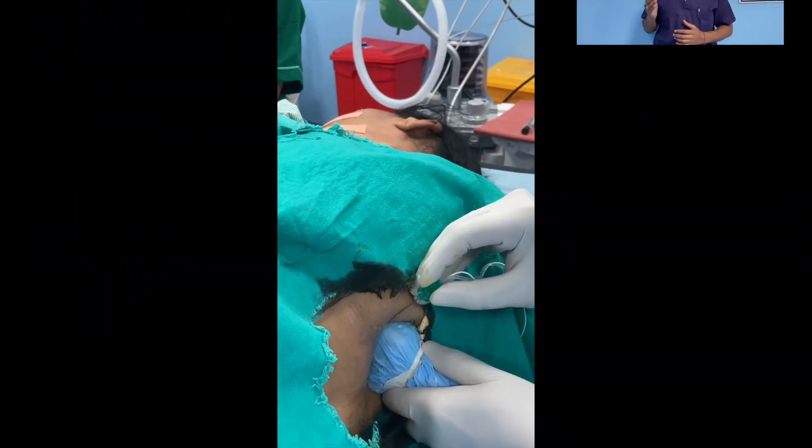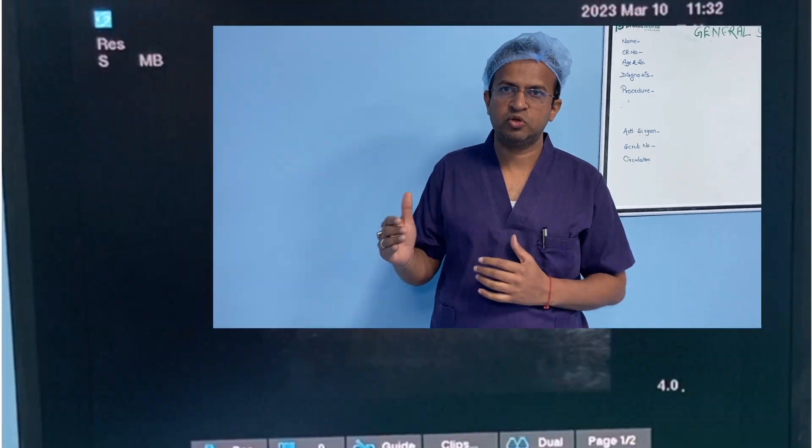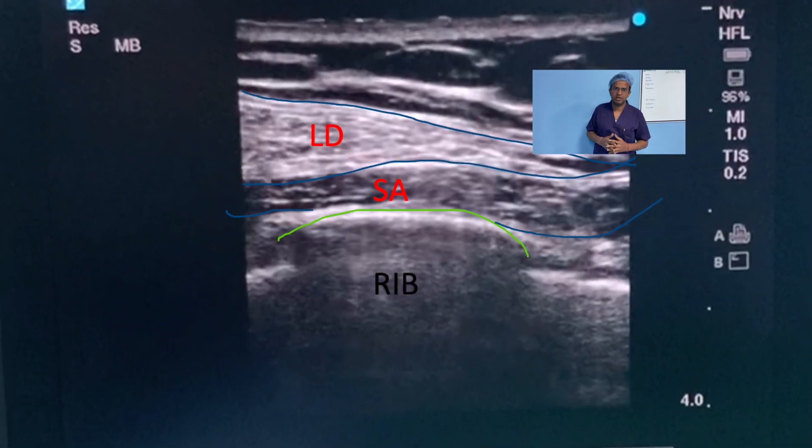To perform the serratus anterior plane block, the patient should be positioned either supine or lateral and the arm should be abducted. Place the linear ultrasound probe in the mid-axillary line at the level of the nipple, and then you can visualize the latissimus dorsi and serratus anterior muscles.